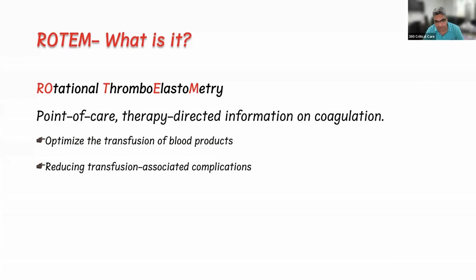In the exam, the expectation is that they will be giving you a picture of a ROTEM and they will be asking you about your interpretation or your management plan. So in this session, for the next half an hour, we'll be talking about ROTEM. I'll go through a little bit of the basics of ROTEM so that you will be acquainted with what it means and, if you are given a scenario, how to interpret it.